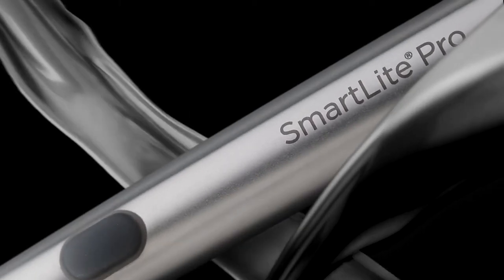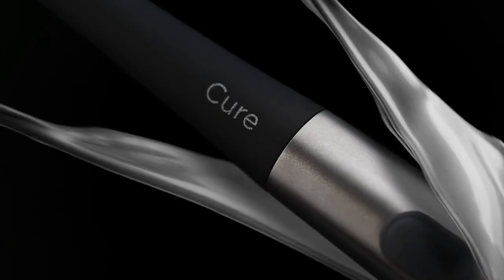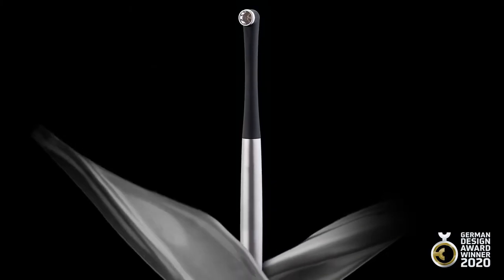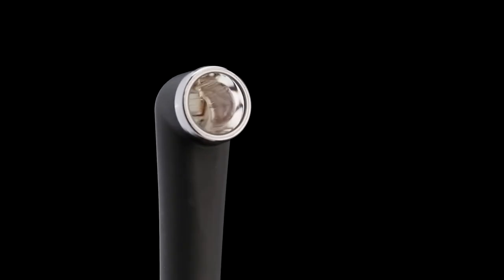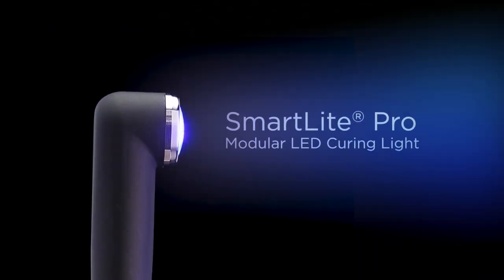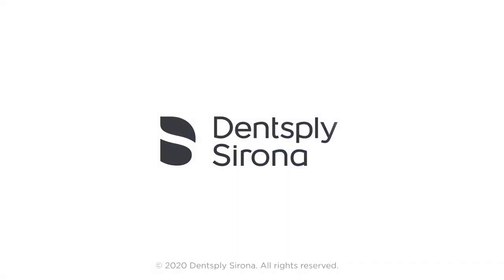With its remarkable all-metal housing, SmartLight Pro delivers far more than good looks. Medical grade stainless steel and aluminum provide robust durability year after year. SmartLight Pro — clinical performance never looked so good. Ask your Dentsply Sirona representative for a demonstration.